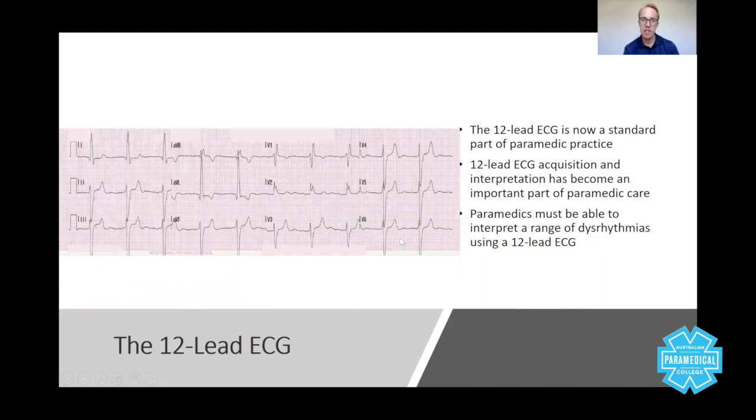Now you will notice in this ECG that they look slightly different, and I'm going to show you why. For those of you who have got any type of understanding of ECGs, you'll see that this is a pretty bad ECG. This patient's probably quite unwell. But the purpose of me showing you this one is for those of you who have never seen a 12-lead ECG before. This is what an ECG looks like. So first and foremost, you have this little square symbol here. And this tells you that the paper speed is 25 millimeters per second and that the machine has been calibrated. Then you have all these different views. So remember what we said about looking at the different angles. That's what this is showing you.